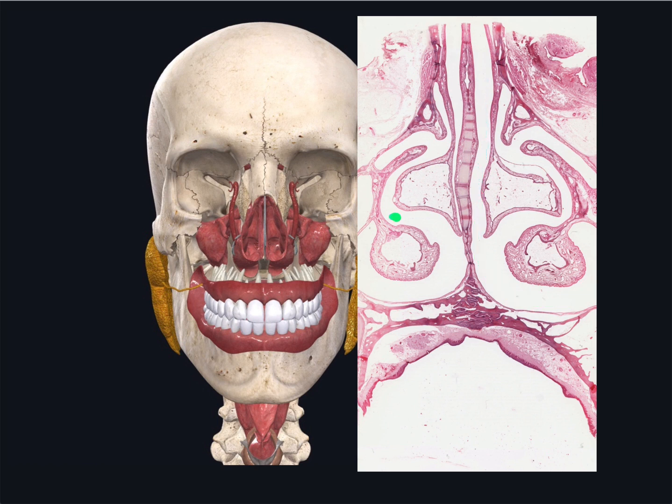The large cavities here on either side of the nasal septum are the air passageways, and protruding into these spaces is a smaller mass and two larger masses on each side, and they represent the superior, middle, and the inferior nasal conchae. They increase the surface area of the lateral walls of the nasal cavity. I'm now going to focus on this area of the nasal cavity to describe the typical mucosal lining of the nasal cavity.